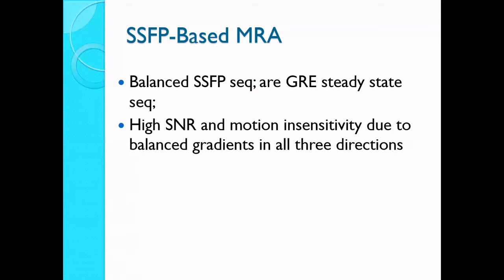So we want to see the full diameter of the blood flow within that particular vessel. That's why it has a high SNR, so that we can see this particular image very brightly. Differentiation, contrast is very good. Differentiation is very important in this particular scenario.